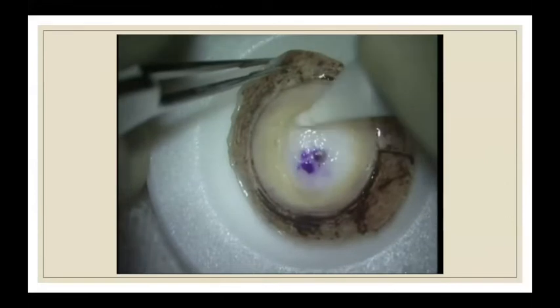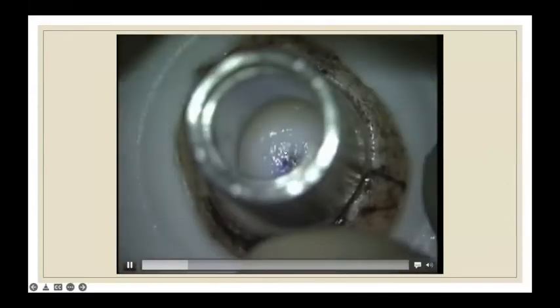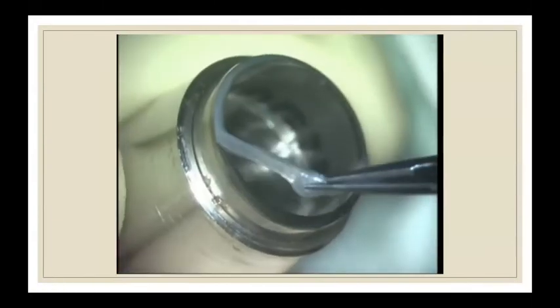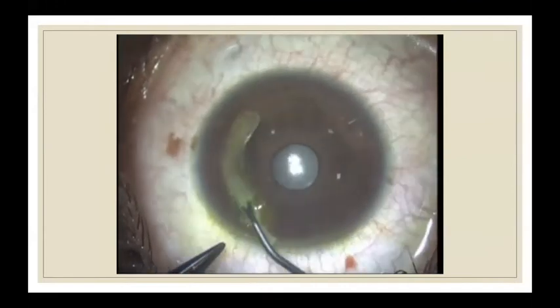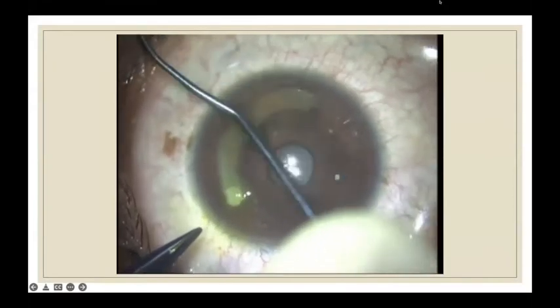And just to show you in a little more detail, when we're using a corneoscleral rim, what I do is first remove the epithelium, then remove the endothelium. Those are the two concentric blades which are placed centered on the rim. And so you get an inner ring of cornea which is removed, and the ring of stroma is then cut into a size, whatever arc length you want, and then it is implanted into femtosecond laser dissected channels within the keratoconic patient's eye.